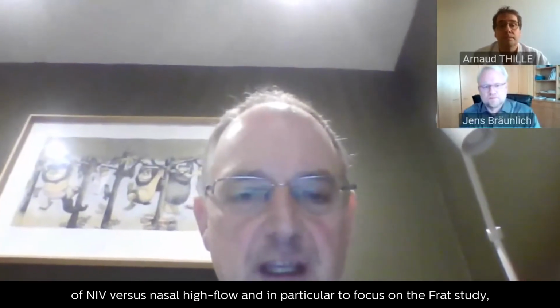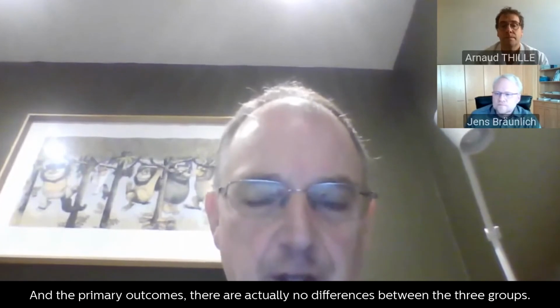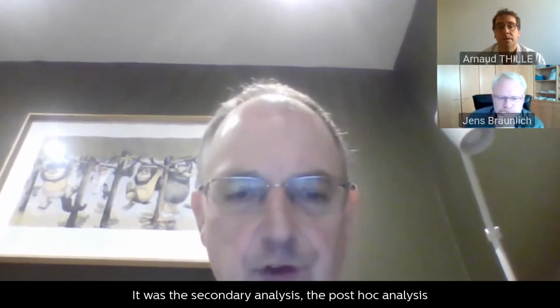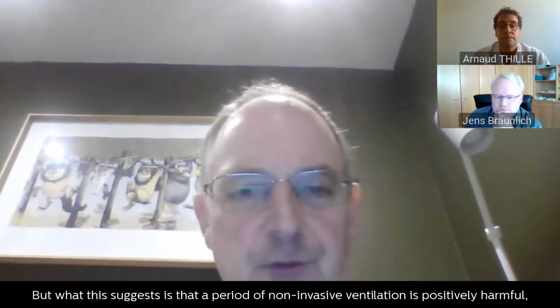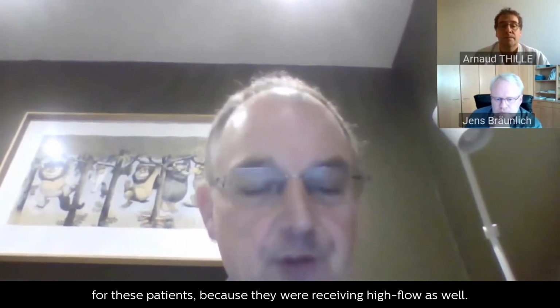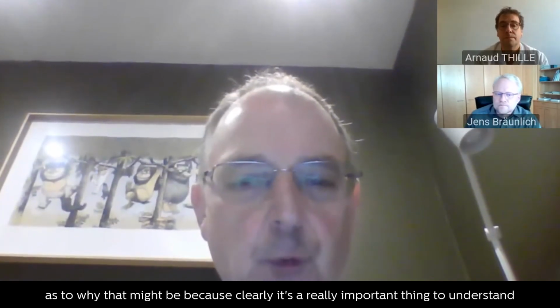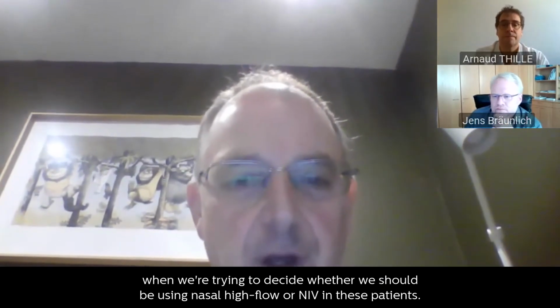I'd like to move on to, Arnaud, really this question of NIV versus nasal high flow, and in particular to focus on the FRAT study, which is the main evidence that we have in this area. The NIV group was NIV plus nasal high flow, wasn't it? So when the patients weren't on NIV, they were receiving nasal high flow. And for the primary outcome, there were actually no differences between the 3 groups. It was the secondary analysis, the post-hoc analysis, or the secondary outcomes that showed that nasal high flow alone appeared superior. But what this suggests is that a period of non-invasive ventilation is positively harmful for these patients because they were receiving high flow as well. So I'd be interested in your thoughts as to why that might be, because clearly it's a really important thing to understand when we're trying to decide whether we should be using nasal high flow or NIV in these patients.